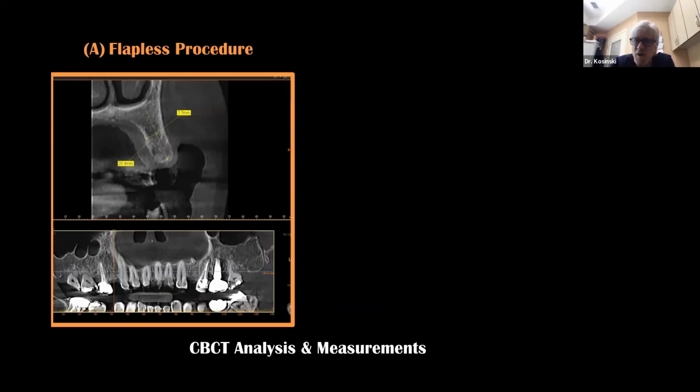I've been doing dentistry a long time, and I remember when the panoramic radiograph came out, that was pretty high tech. This is an instrument or tool that is going to make you much more proficient. Now, that doesn't mean you have to run out and buy one, but there are enough centers around that are taking dental CBCTs for you. There's mobile units and things like that. So you need a CT analysis when you need it. If you're uncertain, then I think it's worth the investment. It's worth it for the patient to make the investment in the CBCT analysis.